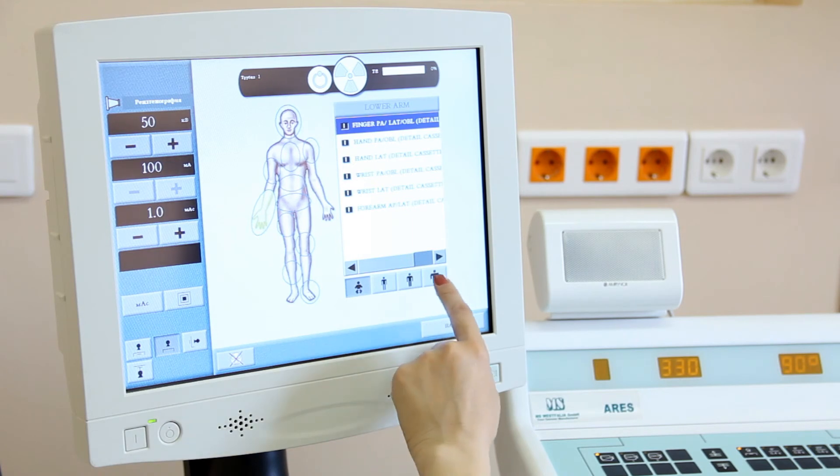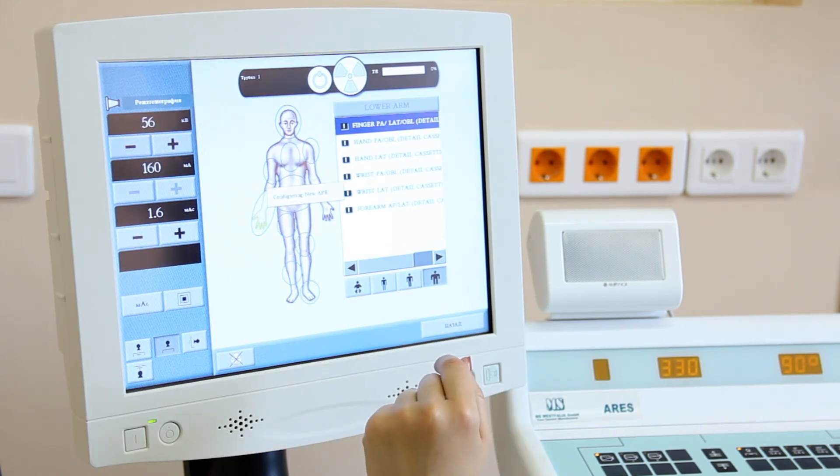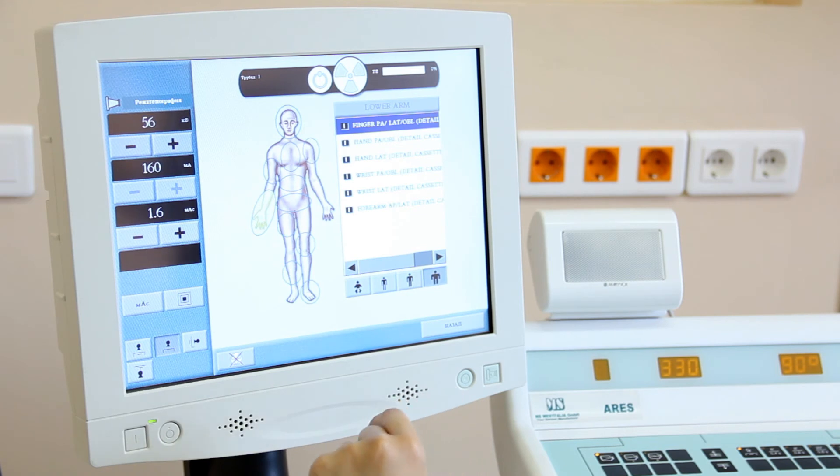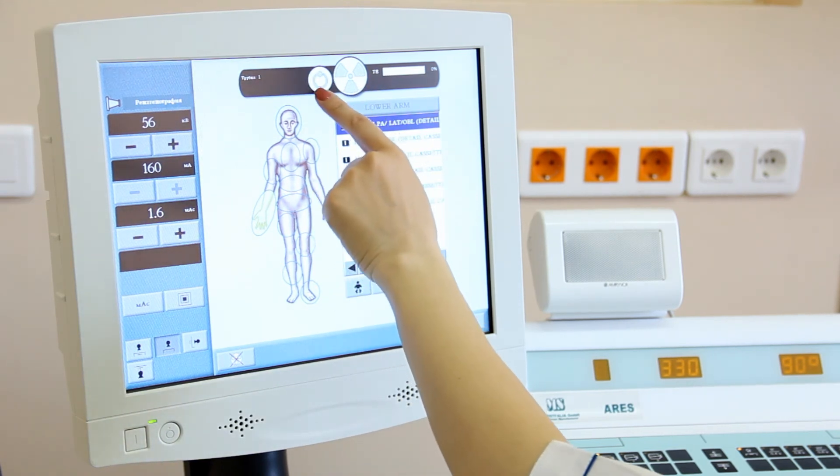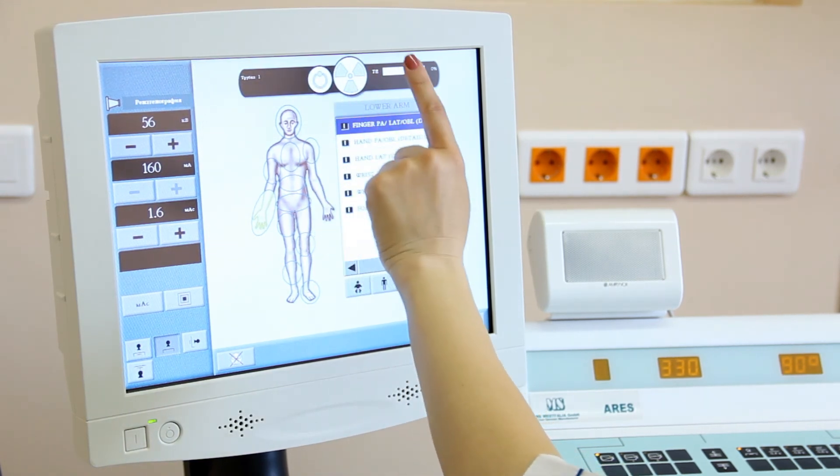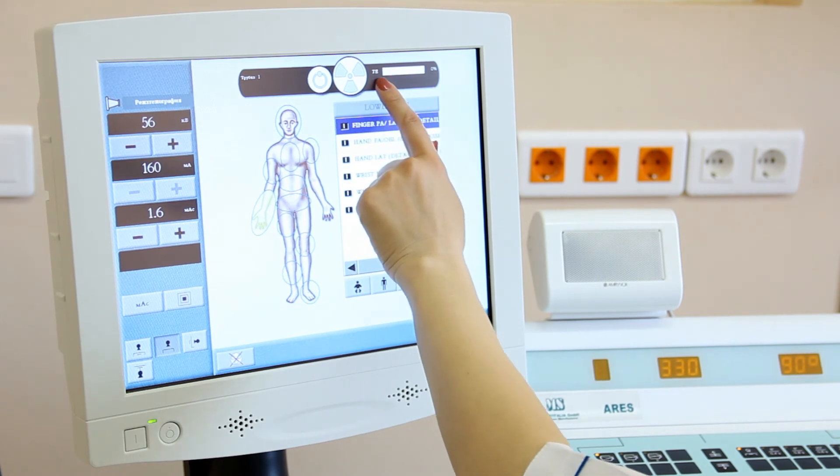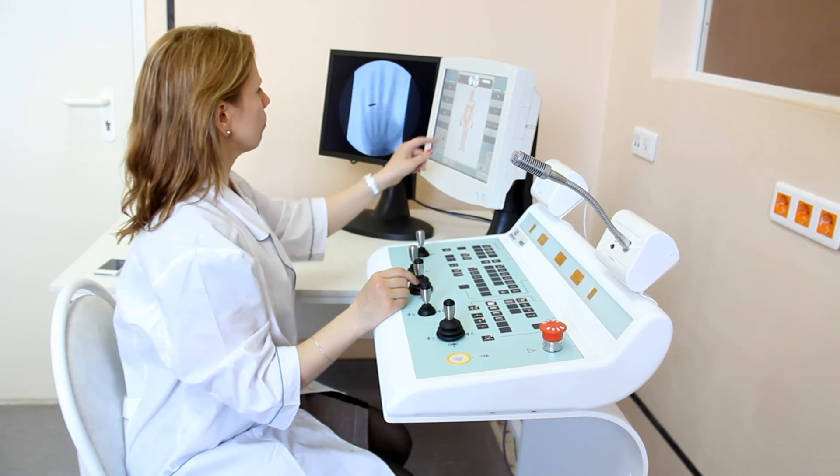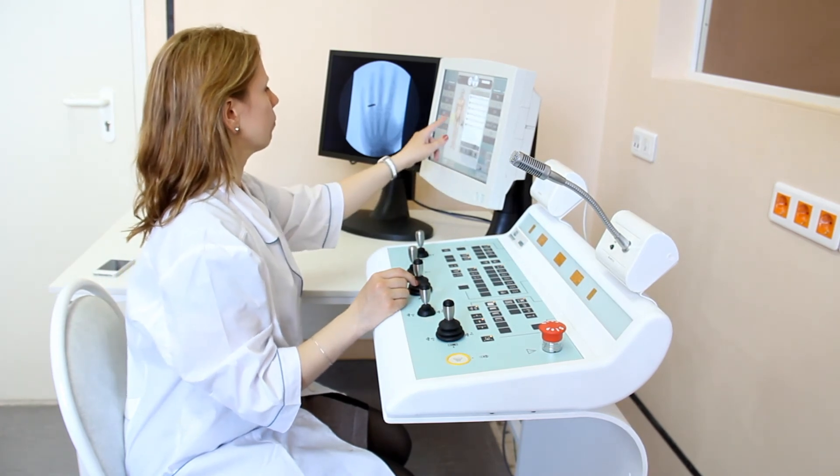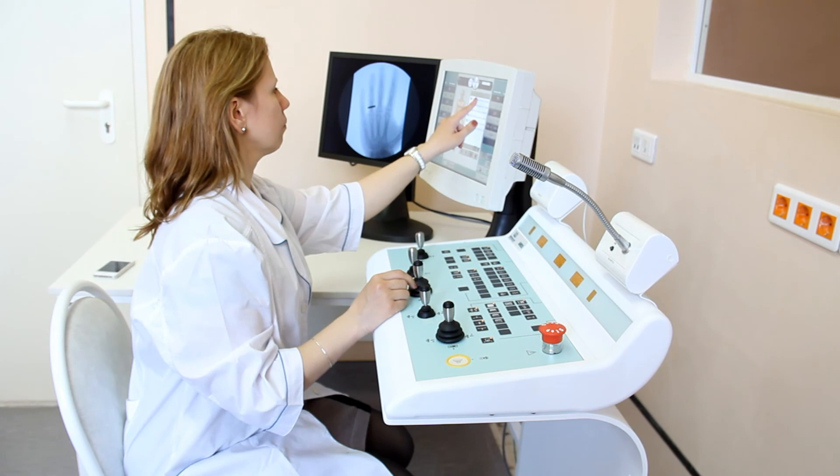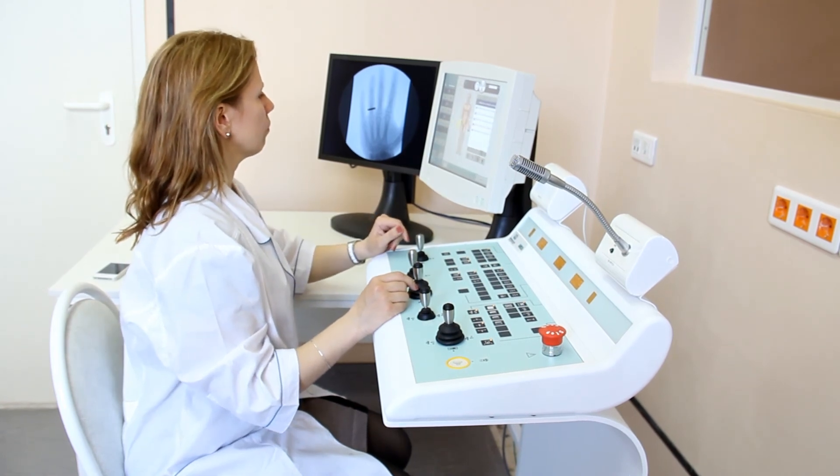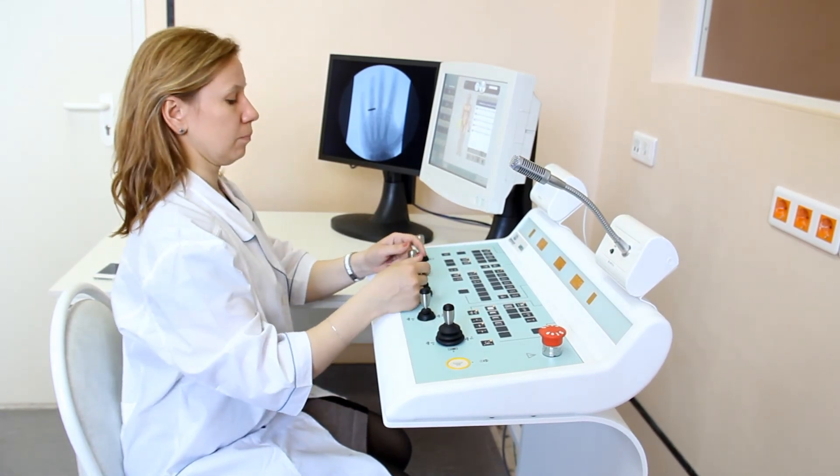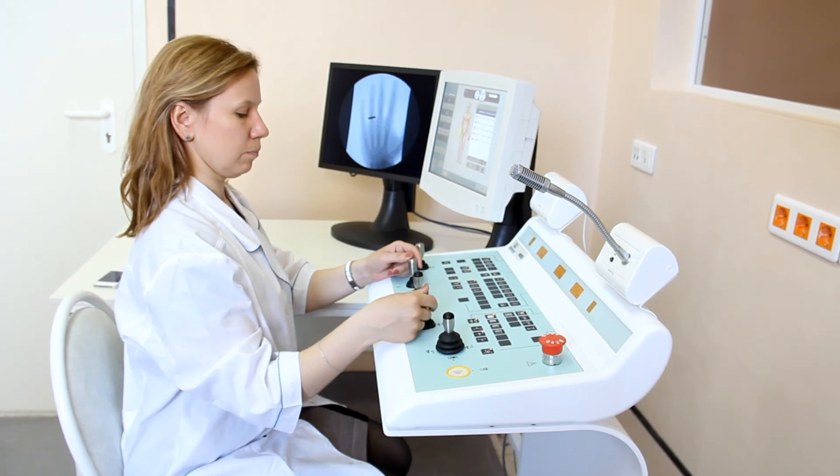The exposure switching parameters and the tube heating level are displayed at the top of the touch screen monitor. The modern modular construction of RSRC with a wide choice of tables, generators, analog and digital video systems and X-ray tubes gives an opportunity to choose any system configuration that would meet individual needs of any hospital.